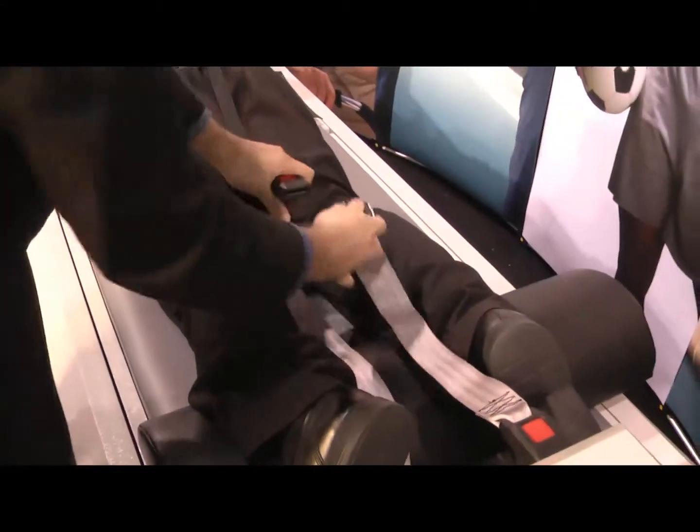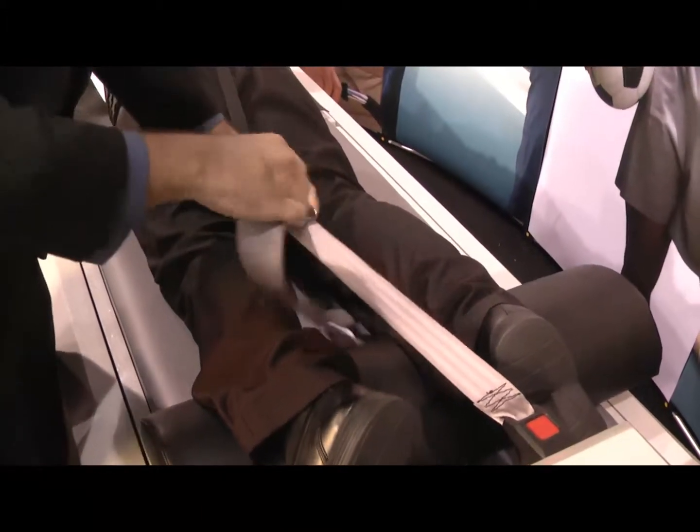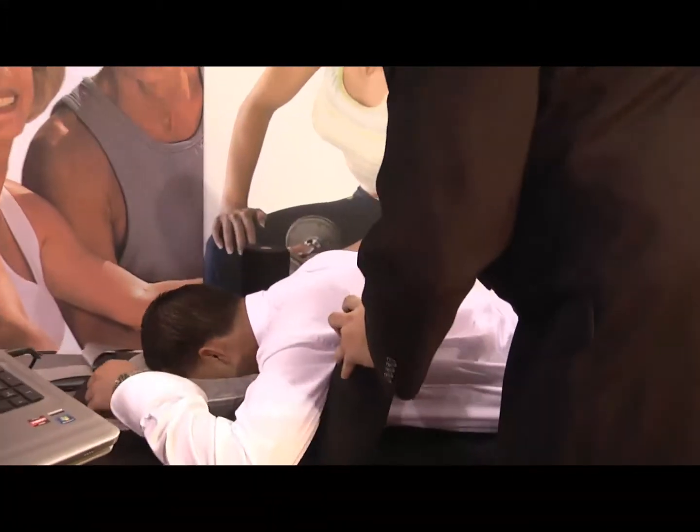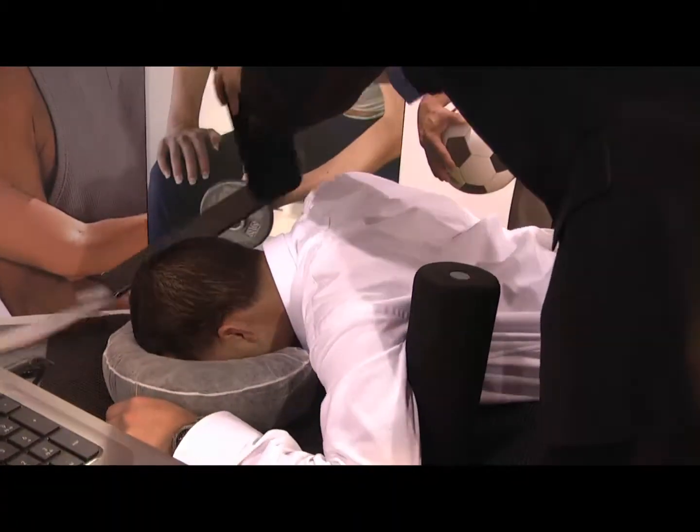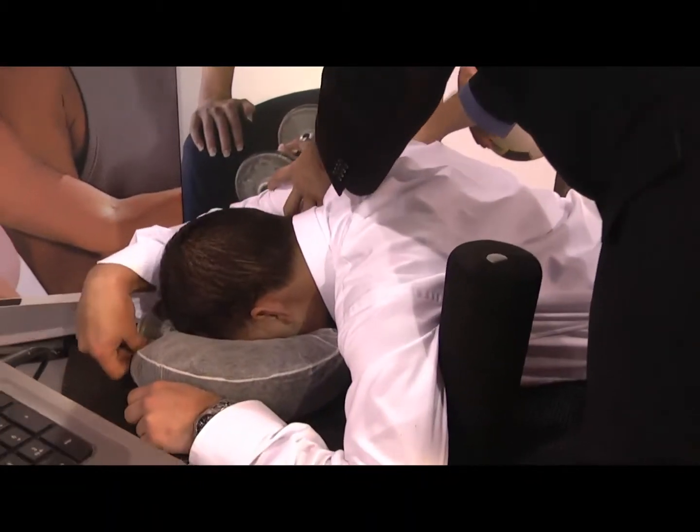The patient will then lay down, holding onto the hand grips on the top of the table, or using the underarm posts if the patient has shoulder problems. The patient can be treated in the prone position or in the supine position, based on the comfort of the patient.